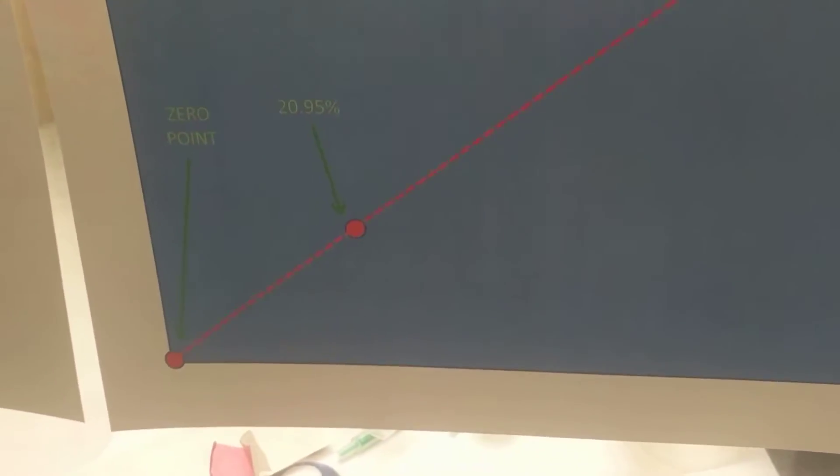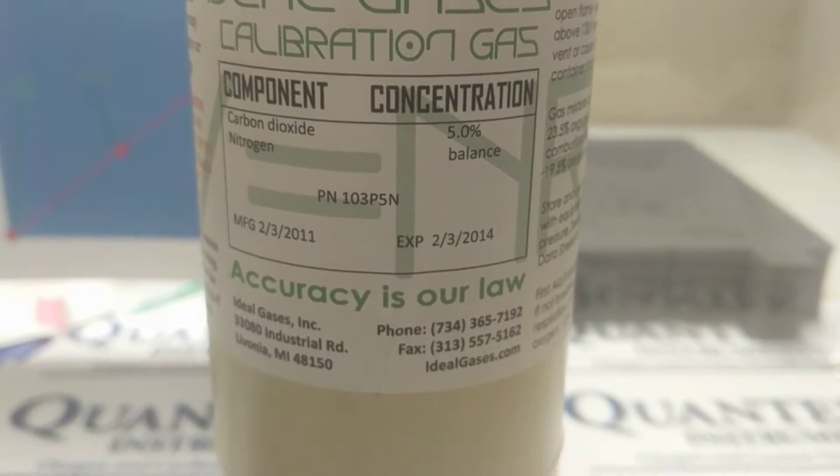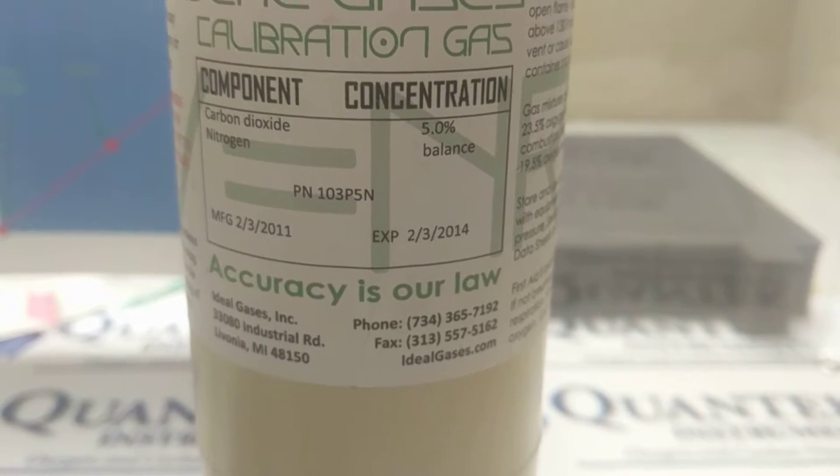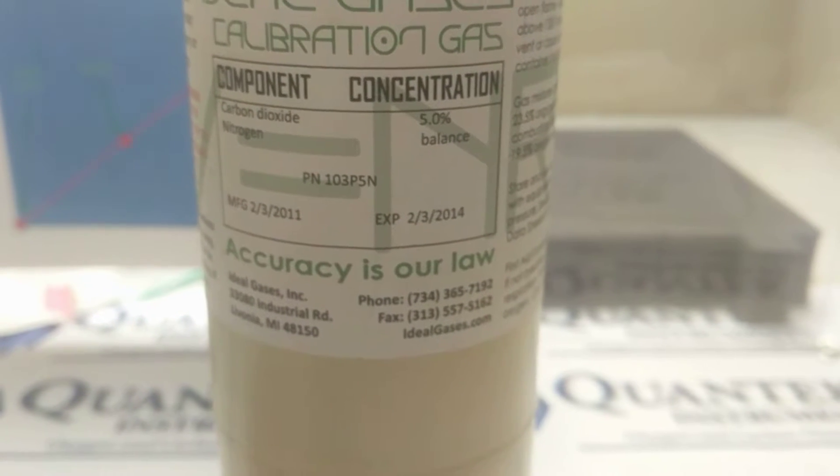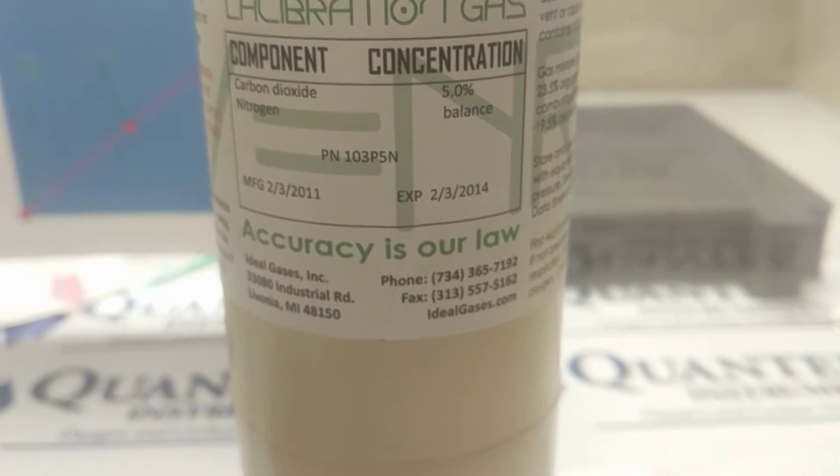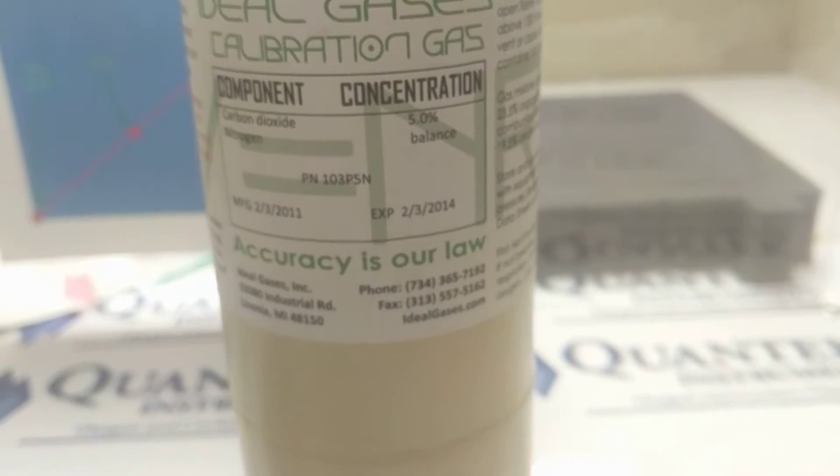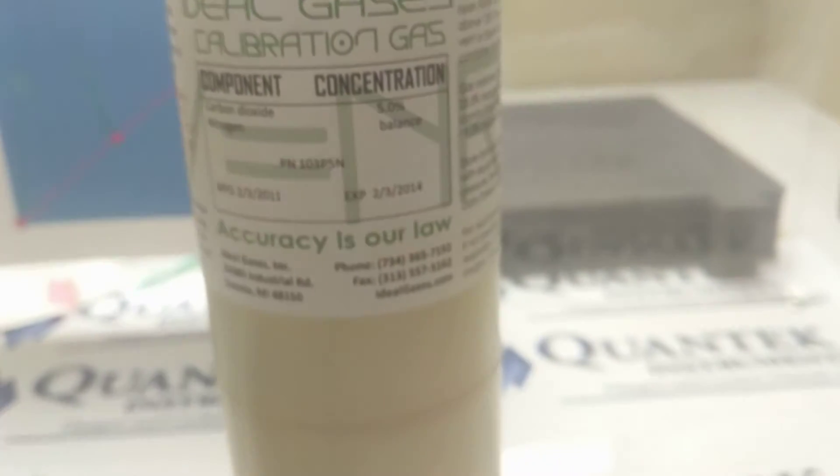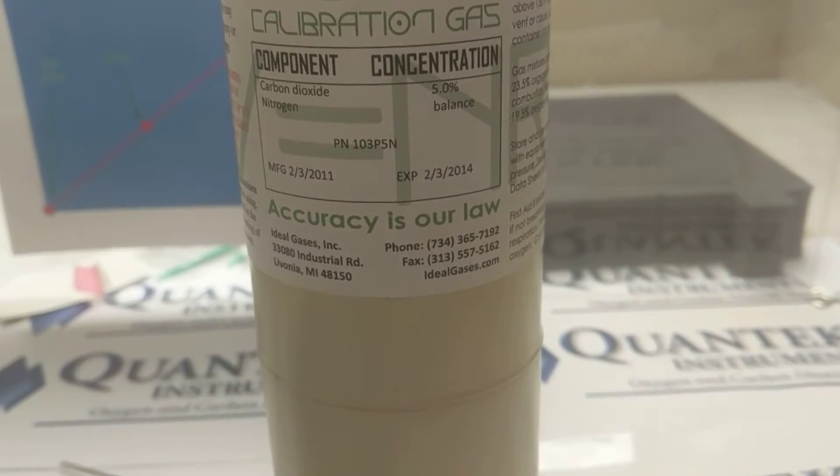So you may be asking yourself, how do we validate the zero? Let's check that. So to check the zero point, we're actually going to use 5% carbon dioxide, 95% nitrogen. You can use any zero gas really, nitrogen, carbon dioxide. Typically we'd use pure nitrogen, but the CO2 will not interfere with the reading at all, and we can use this to zero the instrument just as well as any other zero gas.